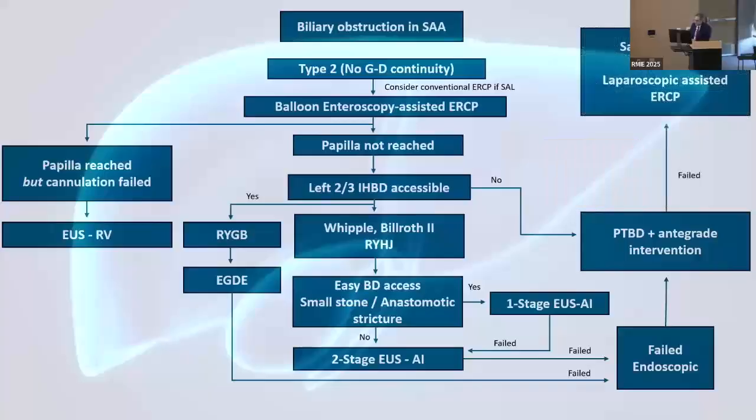And in the unlikely event that this fails, one would then go to more invasive surgical options, which would be either laparoscopic-assisted ERCP or salvage surgery. And again, that's on the basis of high adverse event rates, despite the high or equivocal technical success rate.